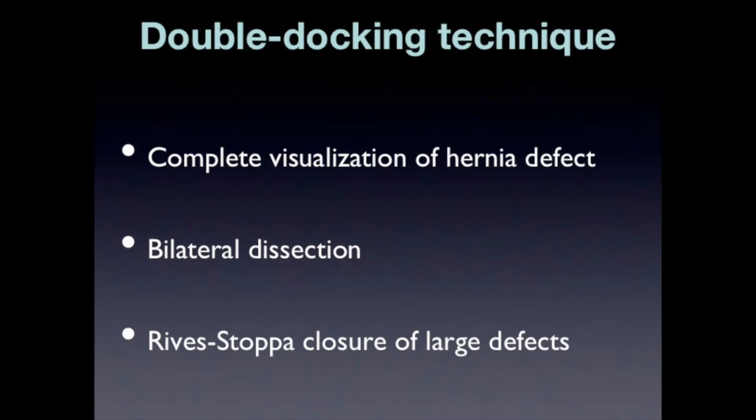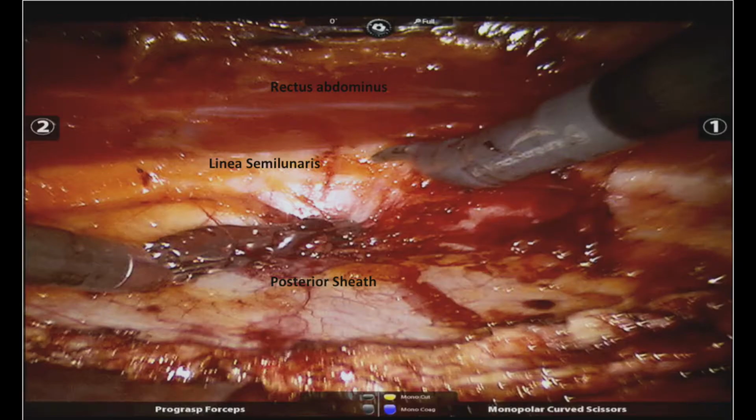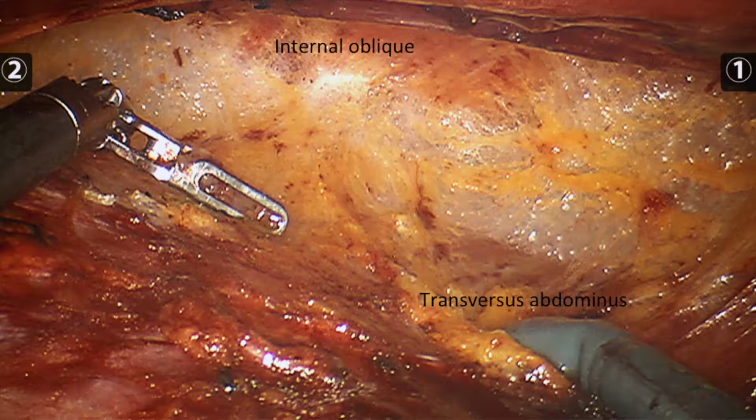The following provides images of the critical steps for the posterior component separation technique. Posterior sheath mobilization, identification of the edge of rectus, incision of the linea semilunaris, and interparietal plane between the internal oblique and transversus.